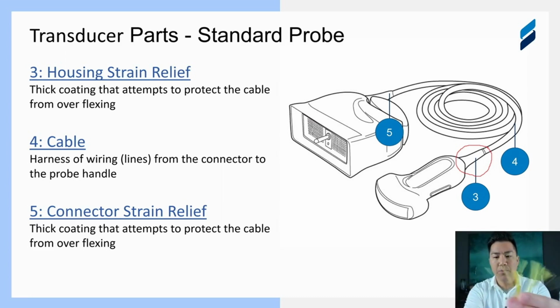Now I'm going to put one in front of you to show this is actually a coaxial wire. What that means is that there's a center conductor, insulation, ground, and insulation around that. So it's actually 4 different layers on this single wire, and the center conductor is finer than a human hair.